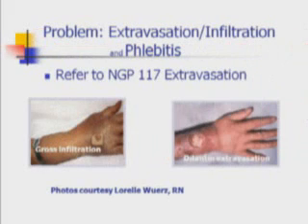Extravasation occurs when a damaging infusion compound infiltrates from a vascular access site into the patient's surrounding tissue. These same compounds can cause phlebitis. Infiltration and extravasation occur with any type of vascular access device, including central venous access devices. Nurses and other clinicians using vascular access devices must assess for infiltration prior to every use. Vascular access sites with infusions running should be assessed at minimum hourly.